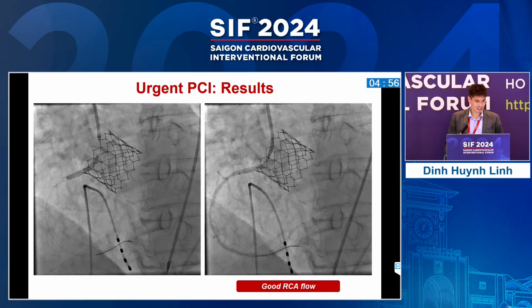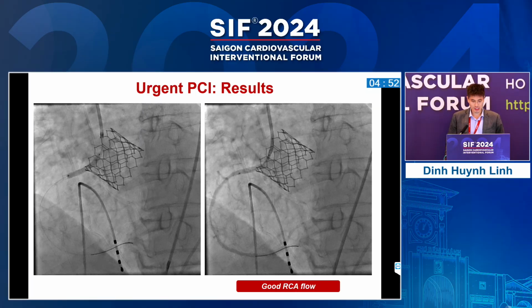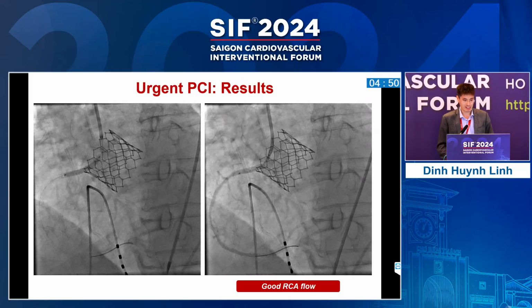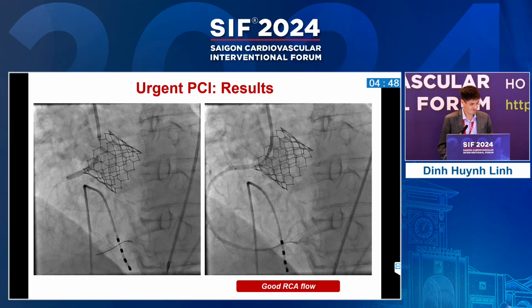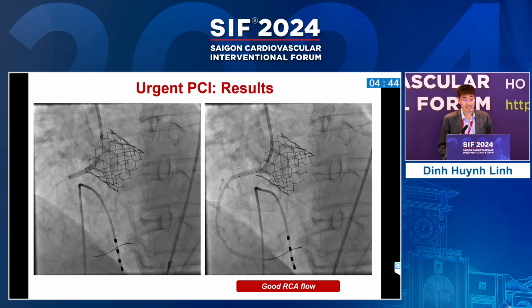So the second question is about the leakage now. What can we do with the leakage now? We had no idea. Maybe the leak. Yes. So did you consider at some point to do an echo to see the pericardium? Pericardium? Yeah. We did.